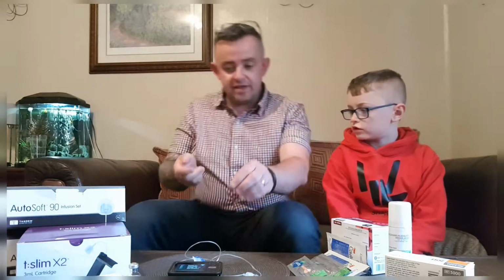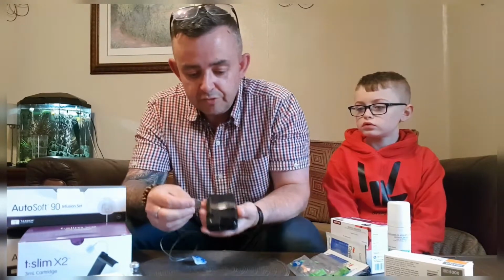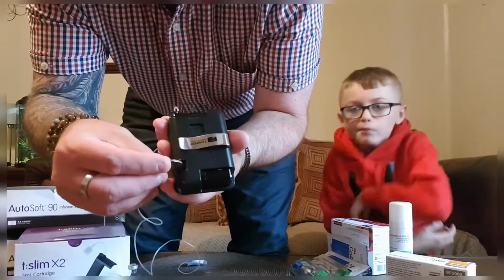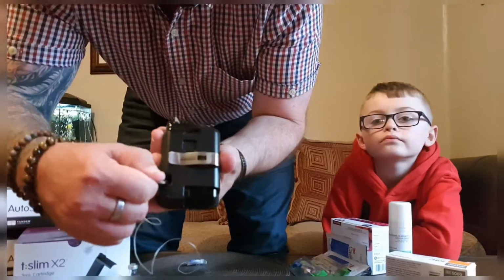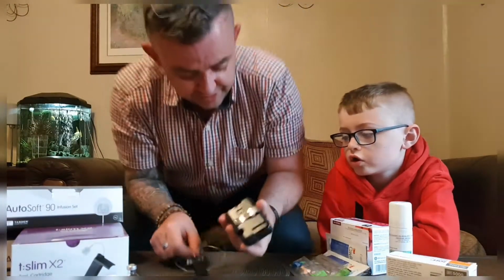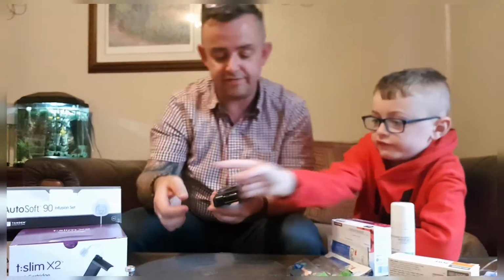So you do get a key, a little black device. But I find a normal coin works. So you pop that in there, and then twist, and it pops it open. It's clever, isn't it? That's the cartridge. Now that can go in the bin. There's no sharp bits on there.